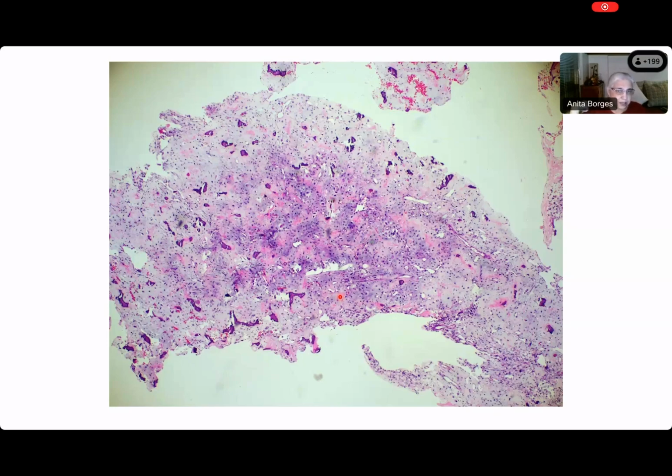Though that space in which you get that pink or light blue material, that is not a gland. That is actually stroma. And those cells are myoepithelial cells which are secreting this material, which is a matrix, that is basement membrane matrix, which is a kind of collagen, sometimes very myxoid, into a space which is not a gland. It is the stroma. Because if you bother to look inside those spaces, you will often find blood vessels as well as sometimes even fibroblasts. So that's why this matrix is an extracellular substance which we have got that is present in the stroma over here.